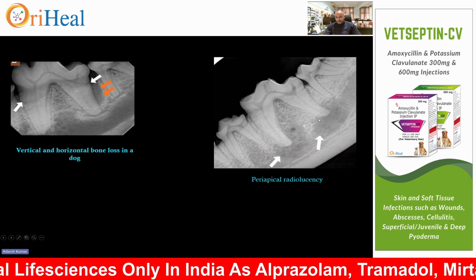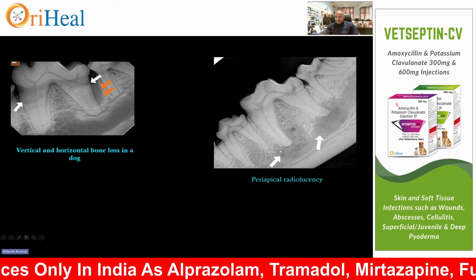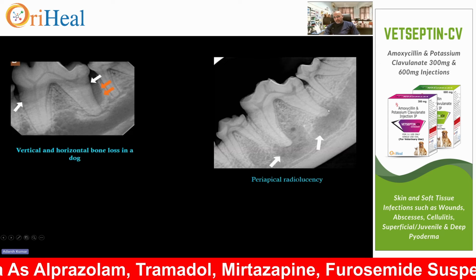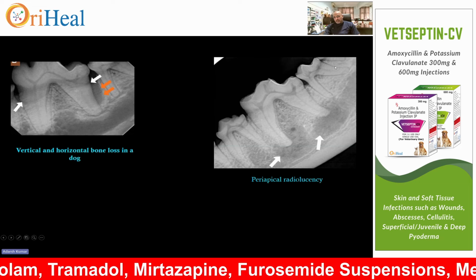So can you see these periapical radiolucencies here? Here also. So the idea is just to see. Now this is a PDL here. So intact, not intact, intact here. Can you see this? The whole of the PDL is intact.